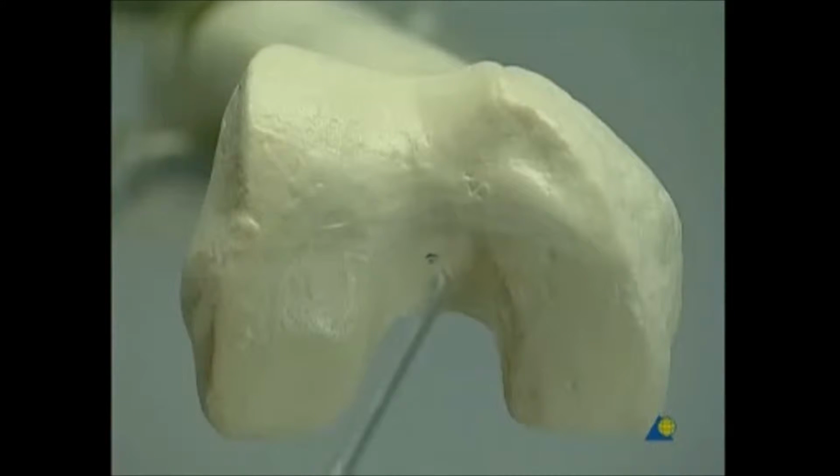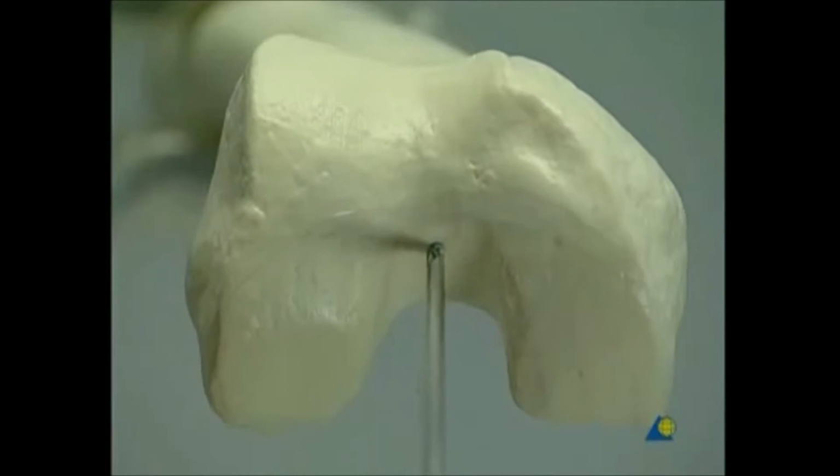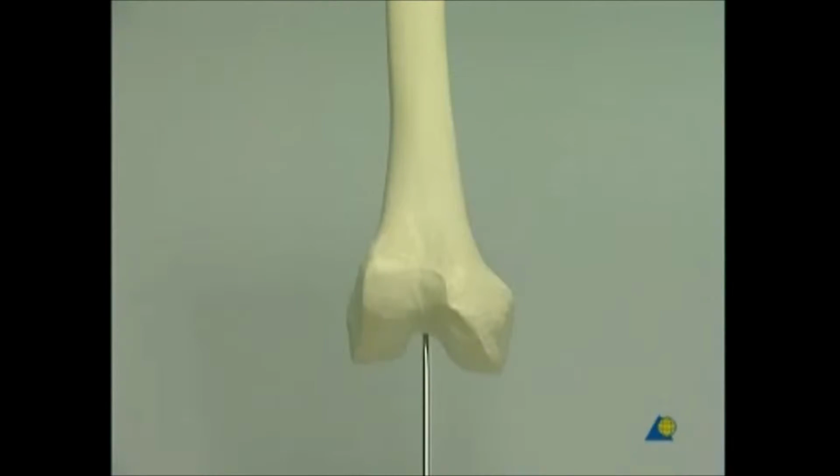The guide wire is inserted 10 to 15 centimeters into the medullary canal in the AP direction and in the sagittal projection along the axis of the femoral shaft. In doing so, the 7 to 9 degree valgus angle of the axis of the femur must be considered.